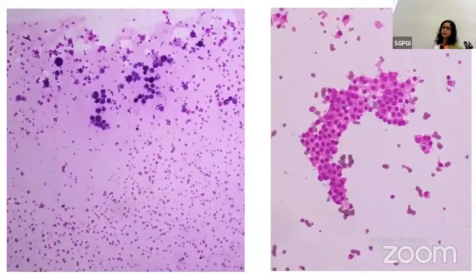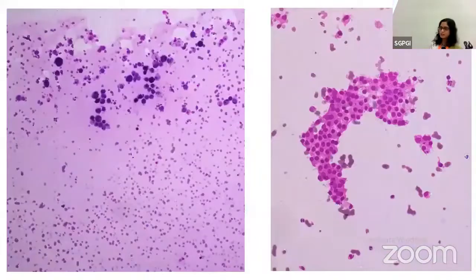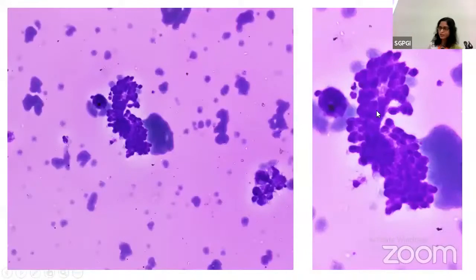Case 9. Again, abundant colloid, a lot of cyst and hemosiderin-laden macrophages in the left-sided image, and an opened up macrofollicle without any nuclear features of PTC. On Giemsa, a lot of colloid in the background, and similar fragments, but they tend to show some nuclear grooving. I was not sure whether to consider the Pap stain as final, that was an outside slide, or whether to consider this atypia as final. So what will you like to call it?